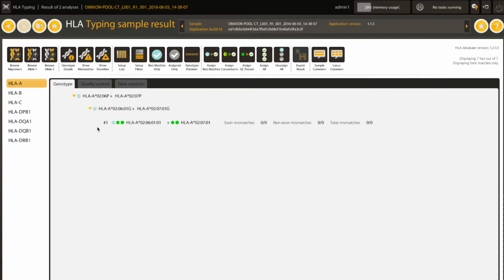If the distance of heterozygous positions is greater than 800 base pairs, then processing more reads will probably not resolve the ambiguity. It can't be resolved with Illumina sequencing data gained with the Holotype kit.